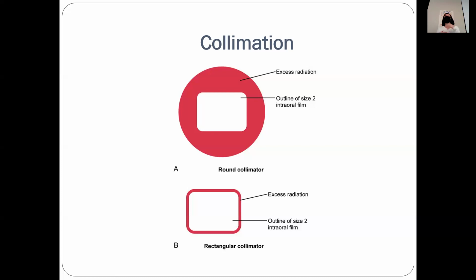So we're not harming our patients with all the retakes we have to take on them. It's not any more radiation than they would normally probably get. So that's why we choose to do the BID. I had the hardest time getting used to that thing. I was like, why do we have these? But now it totally makes sense to me. And the more you practice with it, it typically gets a little better.